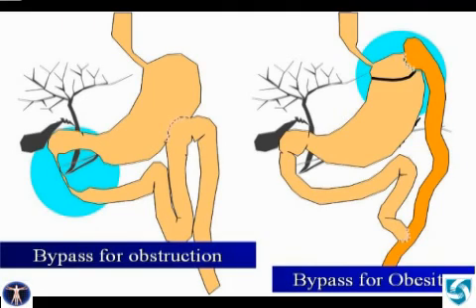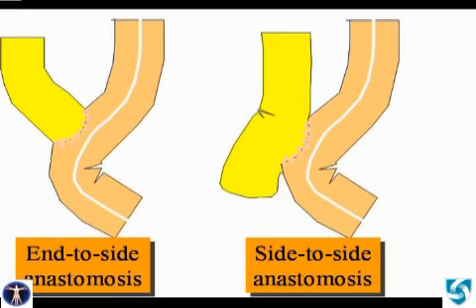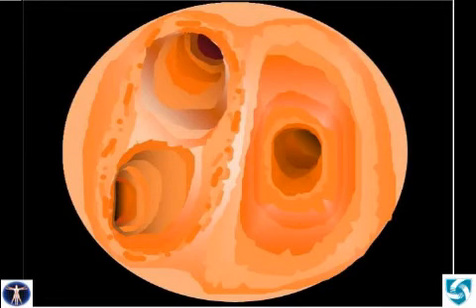and emptying into an end-to-side gastrojejunostomy, which is reconstructed as a Roux-en-Y jejunojejunostomy to maintain continuity with the duodenum, pancreas, and biliary systems as shown. The jejunojejunostomy, commonly known as the Y anastomosis, may be created either as an end-to-side or a side-to-side anastomosis. This will present the endoscopist with either a 2-lumen or 3-lumen choice of routes to the papilla, as shown in this cartoon.